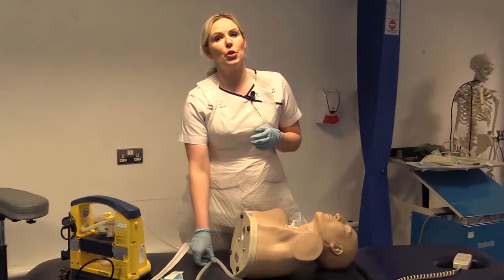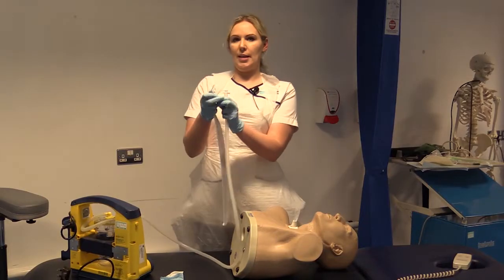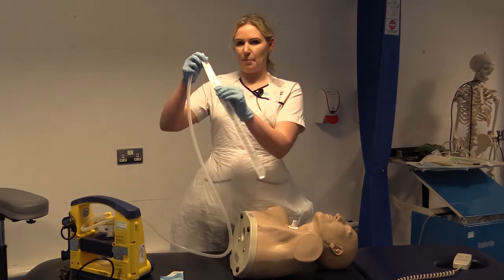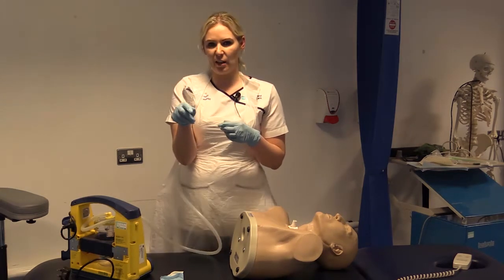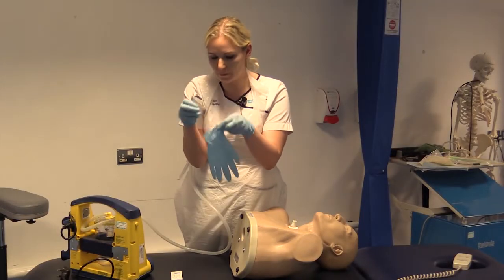So we're going to choose our appropriate sized catheter. We're going to insert into our suction tubing just by exposing the upper end and attaching it in, keeping the rest of the catheter in the plastic sleeve to keep it as clean as possible. We're going to pop that in underneath our arm. We're going to apply our second glove, and that's going to be our clean hand and the only hand that touches the catheter.